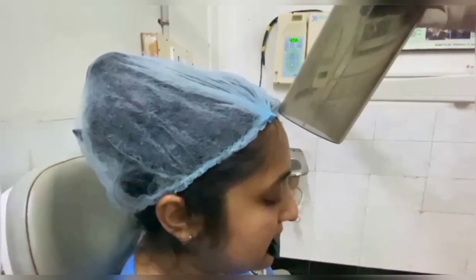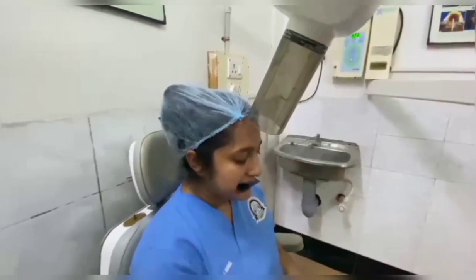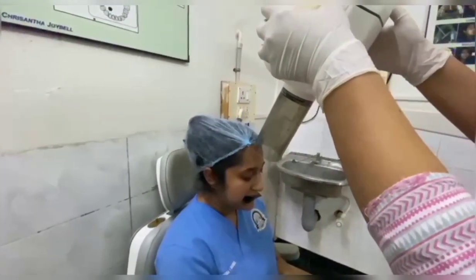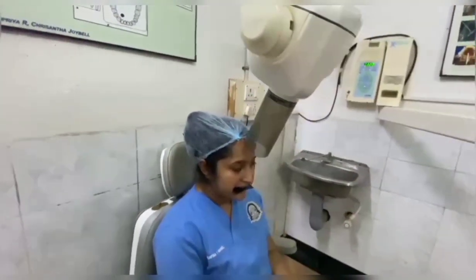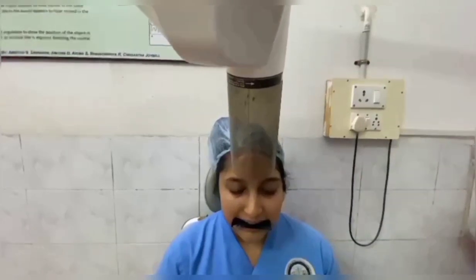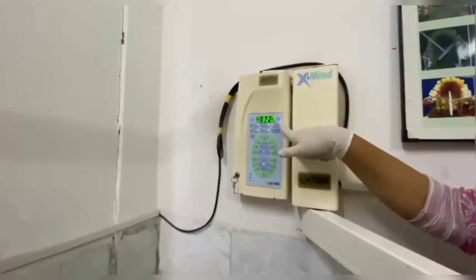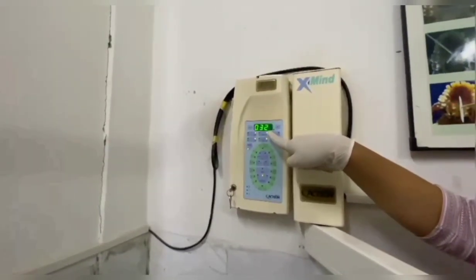This projection shows the palate, the zygomatic process of the maxilla, the antero-inferior aspects of each antrum, nasolacrimal canal, teeth from the right second molar to the left second molar, and the nasal septum. Exposure time for occlusal radiographs is 0.32 seconds.